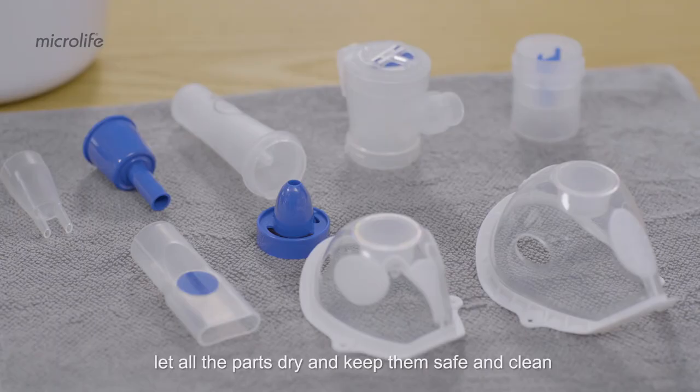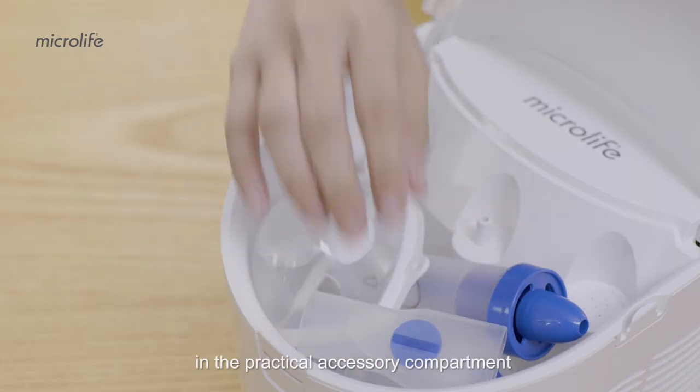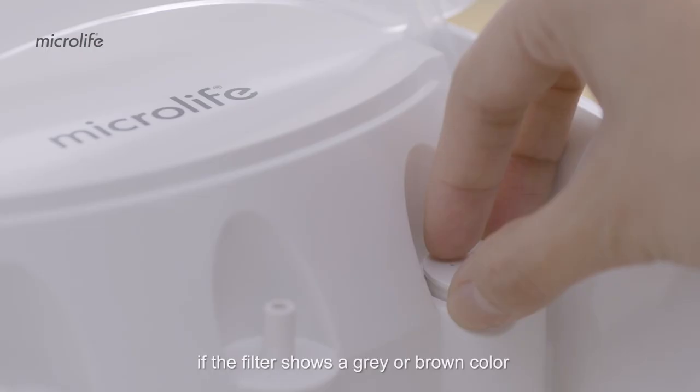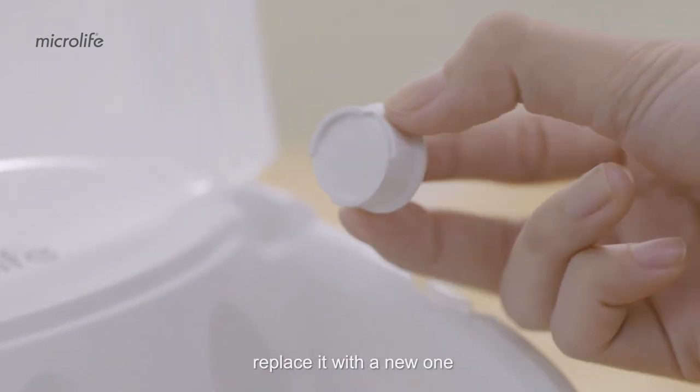Let all the parts dry and keep them safe and clean in the practical accessory compartment so they will be handy for the next treatment. If the filter shows a gray or brown color or is wet, replace it with a new one.